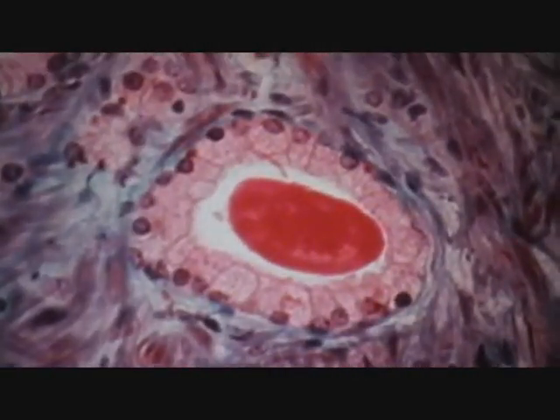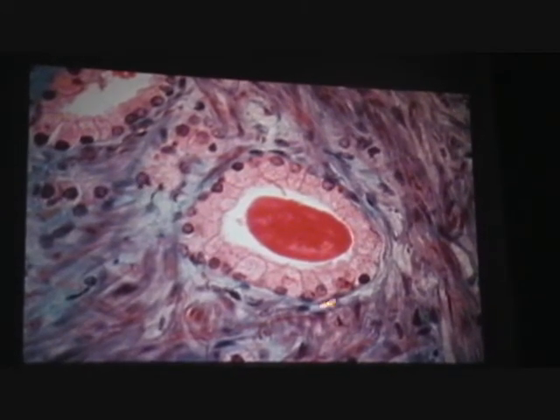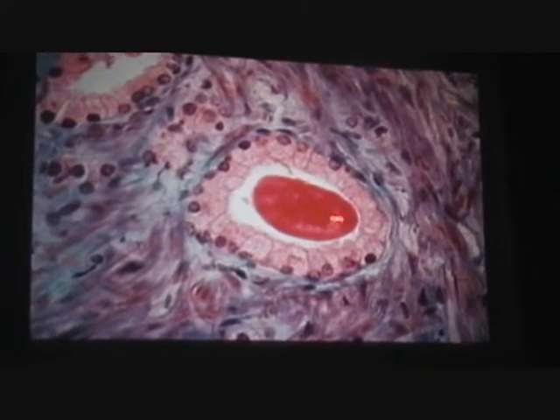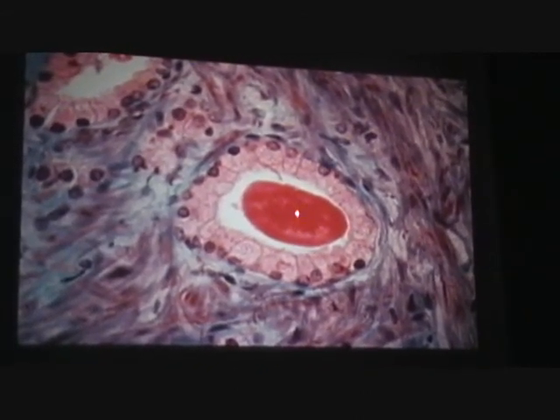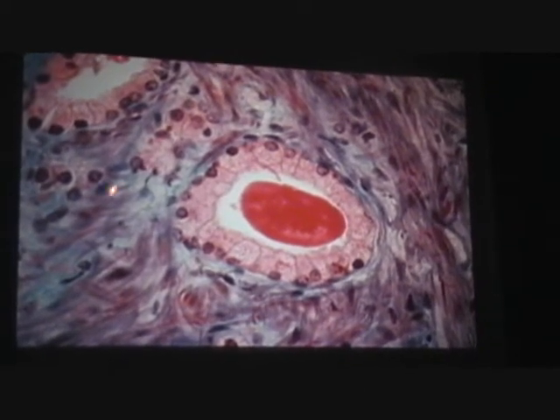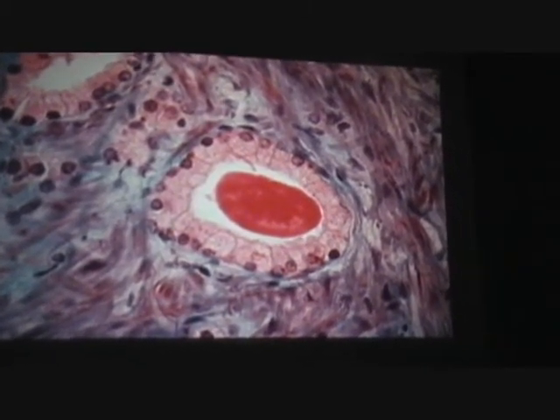And then a better stained specimen, really giving you a sense of these fibromuscular bands, smooth muscle fibers here. Little alveoli with this age-related deposition, glycoprotein. Even a little one starting there, but that's a really good example and can be initially confused with colloid. Seeing all of this should keep you away from thyroid. Make sure you get a really good look at that banding.